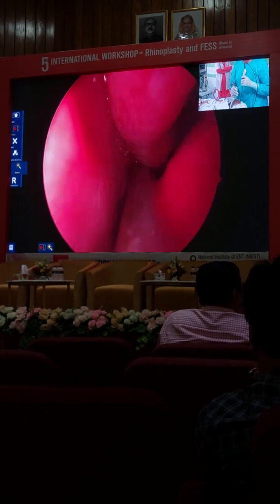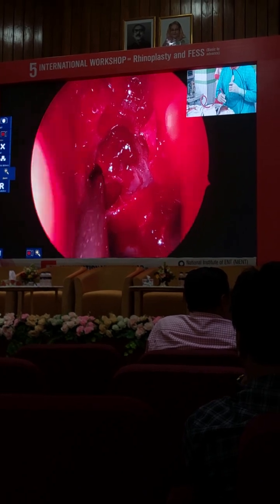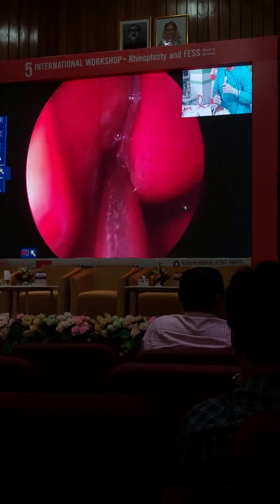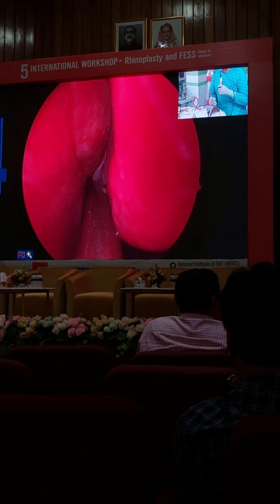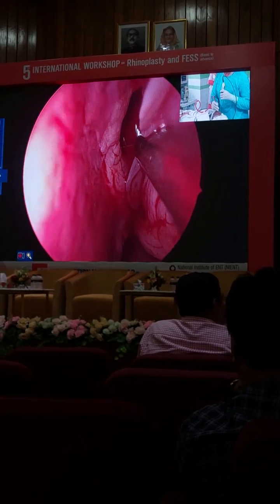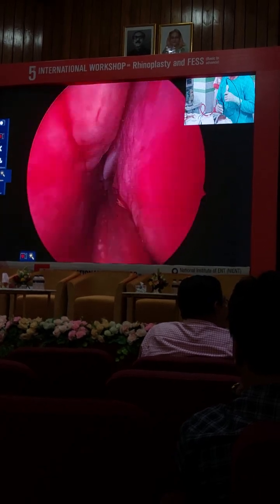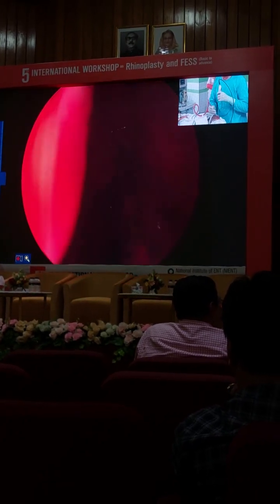And in this case, it didn't matter to me whether I went medial or intermediate, because I still need to go here to clear these polyps in the inferior half, right? So we can still further confirm that we are in the sphenoid. Can you see that? Beautiful. Anterior wall. Okay, so we're going to take out a little bit of this polypoidal thing, but not go in this upper half.